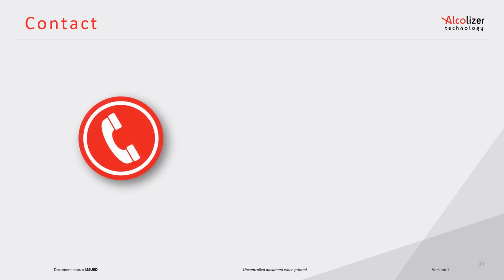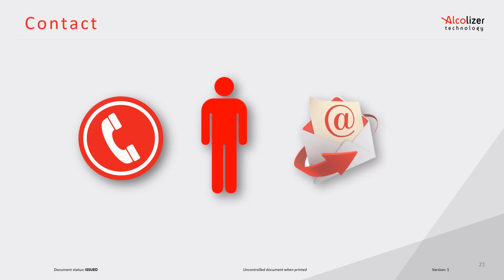Contact Alcolizer Technology if at any time you require further assistance with the on-site testing app.